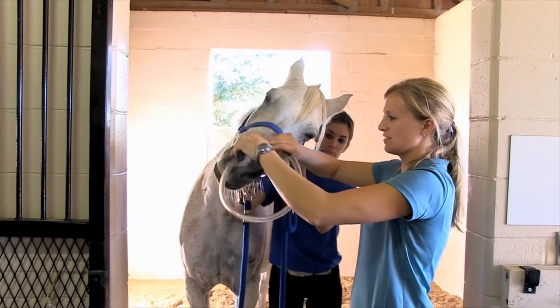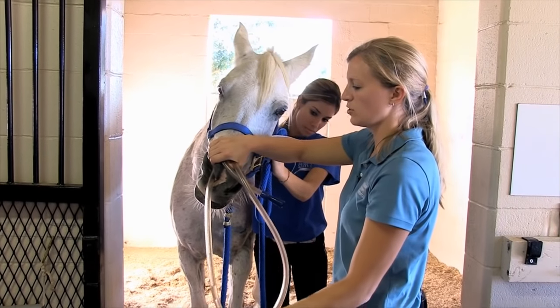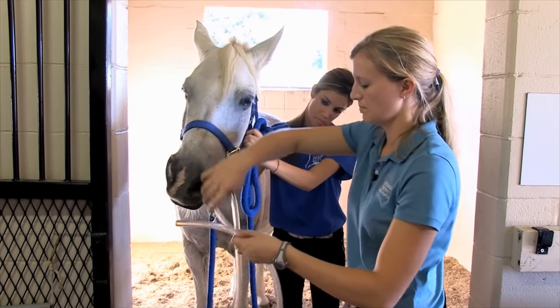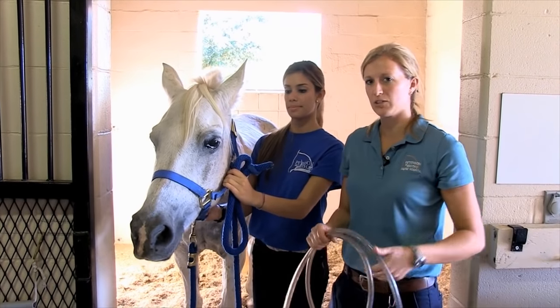Make sure the horse's head is kept nice and quiet when you're pulling the tube, because as it comes through the nose it can flick up and give them a bloody nose. Pull it out nice and slowly. That concludes how to give a medication by nasogastric tube.